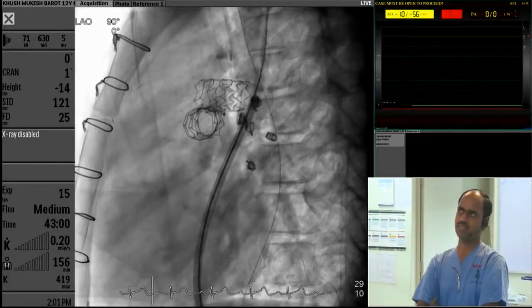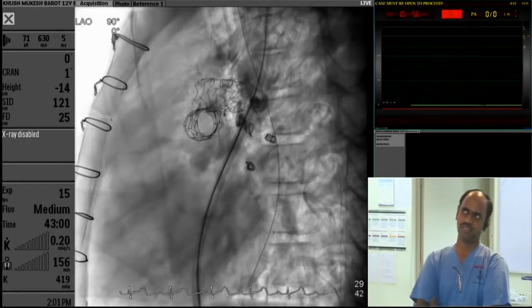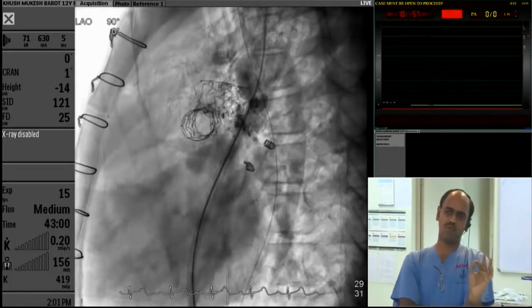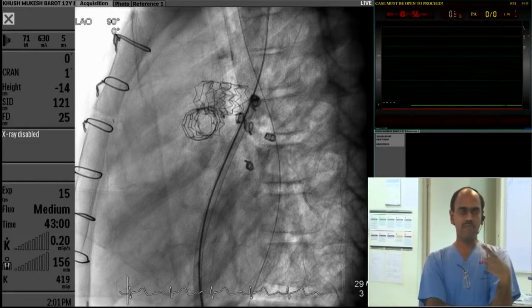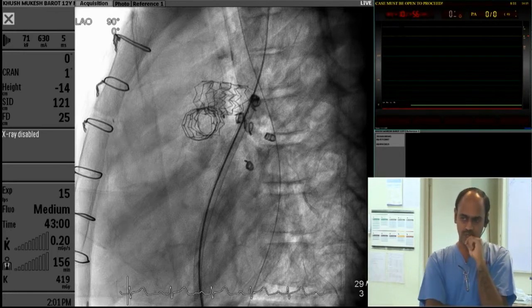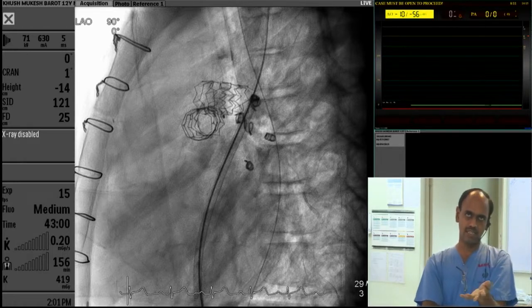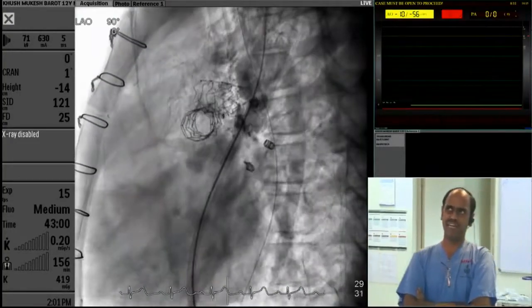There is some flow from that injection which is not looking normal. This patient had a superior vena cava obstruction for about one and a half years, and his whole chest is full of a lot of veins. When we injected into the superior vena cava, it was mainly collateralized by the azygous, but there were quite a lot of veins that filled everywhere. Now I do understand there is some sort of flush here and there — contrast is going into some areas we don't like. Is it something going into the pulmonary artery in that SVC injection?